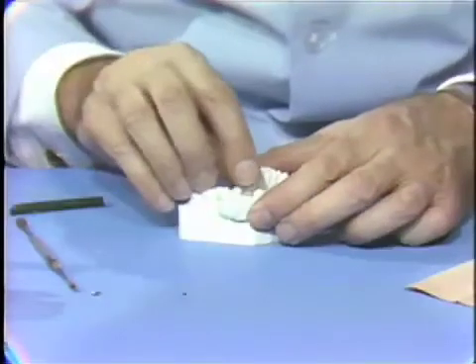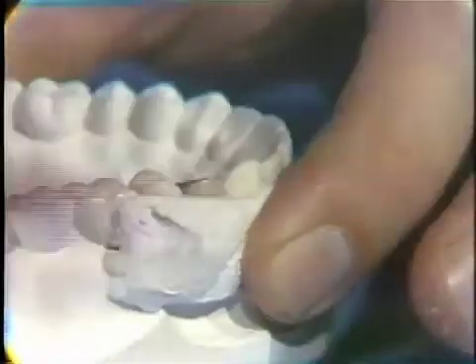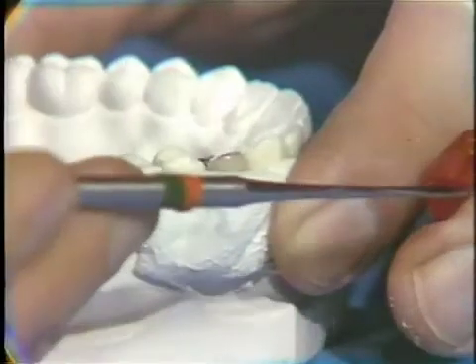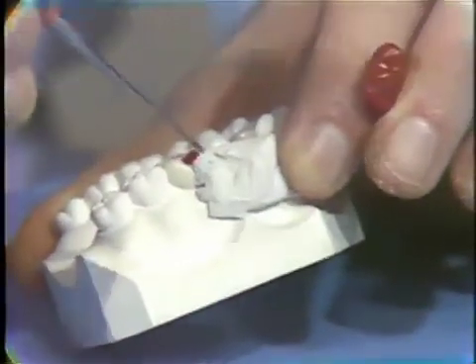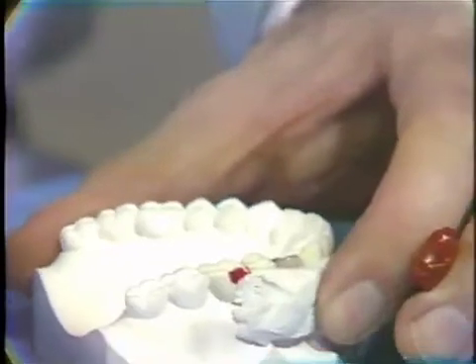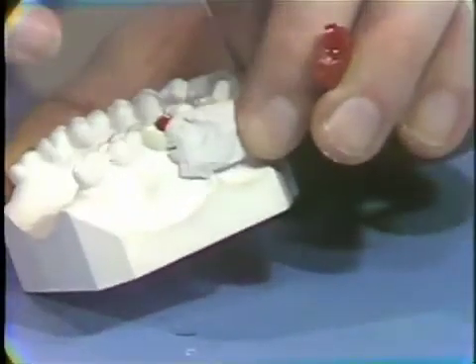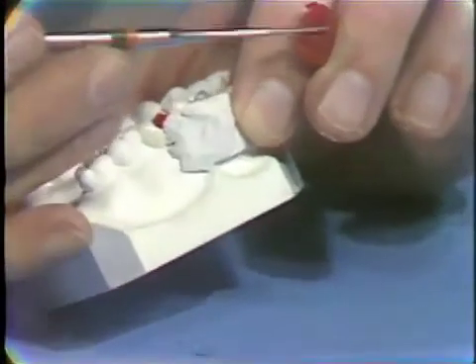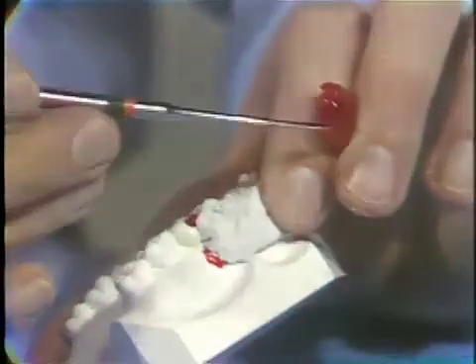Now, this is going to hold the tooth in position whilst the occlusal surface is waxed up, and it's generally necessary just to tack the plaster core in position, preferably with a little sticky wax to hold it in position on here whilst the occlusal waxing is done.